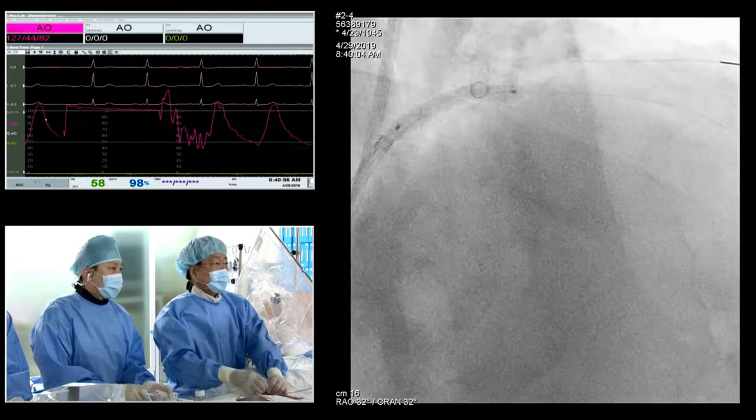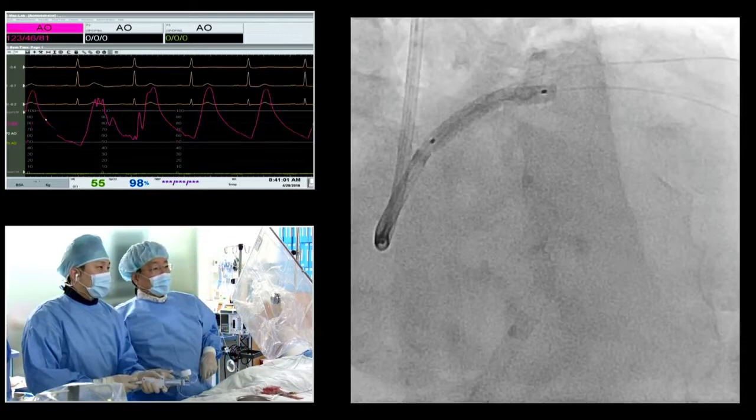12. SJ, as you're inflating, can you comment on what stents you think are best for left main? Are there particular characteristics of stents that you like for left main as opposed to other stents?